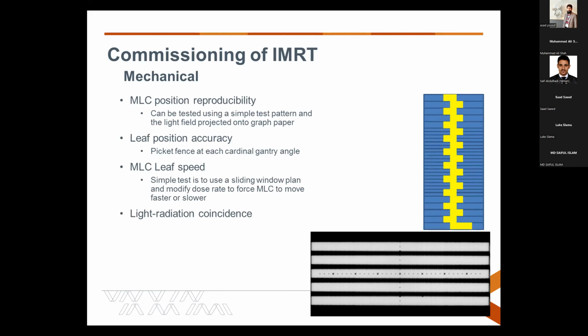And then obviously your light radiation coincidence is another important test.